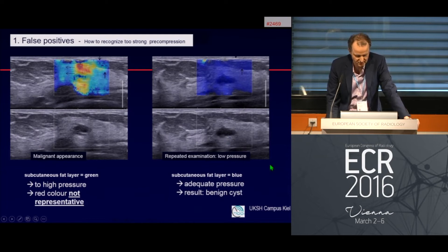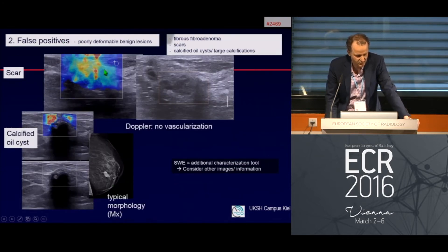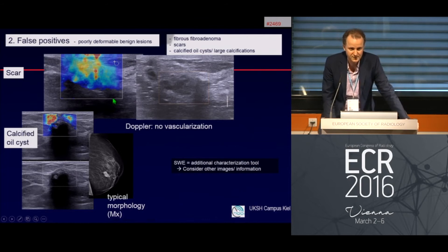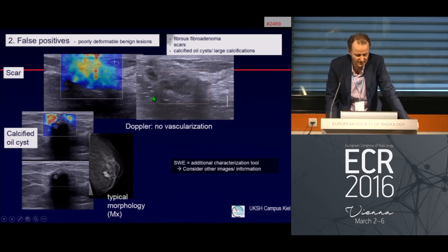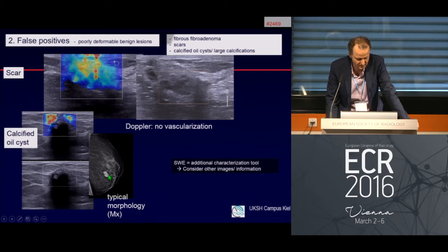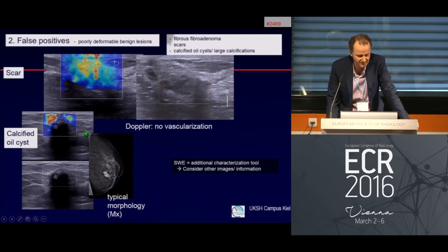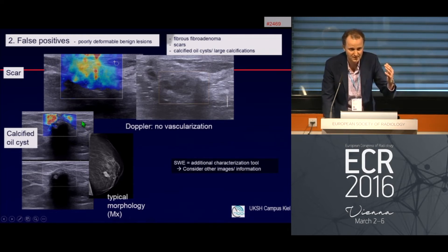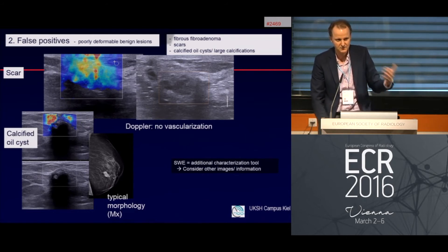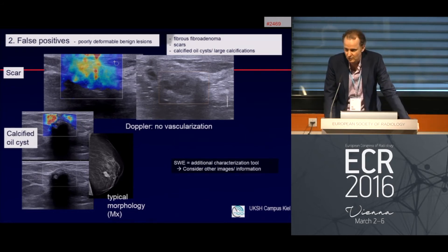Other false positives include scars, fibrous fibroadenomas, or calcified oil cysts. A very large calcification visible on mammogram causes dorsal shadowing, producing a complex lesion in B-mode with a signal gap in the center and stiff findings around the lesion. Keep this in mind for probably benign findings after breast-conserving therapy or other breast excisions.